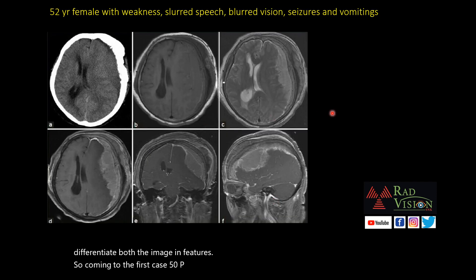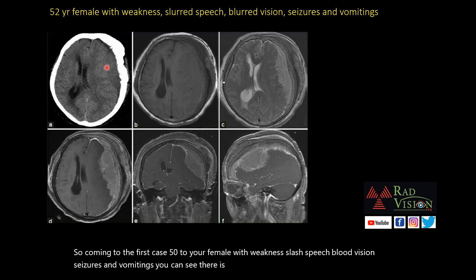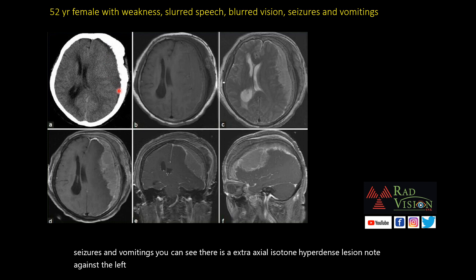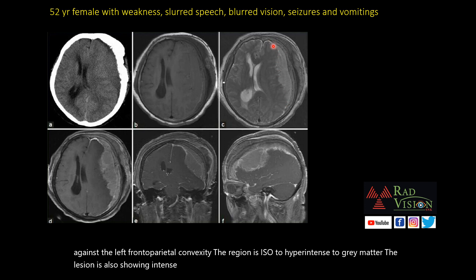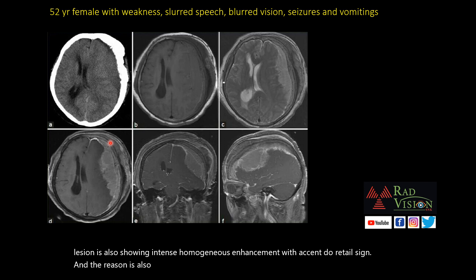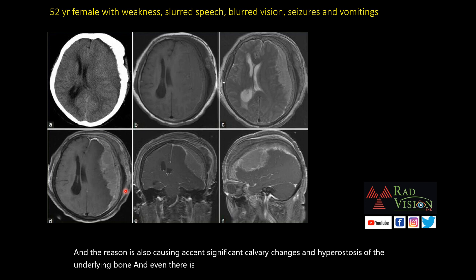Coming to the first case: a 52-year-old female with weakness, slurred speech, blurred vision, seizures, and vomiting. There is an extra-axial iso- to hyperdense lesion against the left frontoparietal convexity, iso- to hyperdense to grey matter, showing intense homogeneous enhancement with a dural tail sign. The lesion is also causing calvarial changes and hyperostosis of the underlying bone, with extra-cranial spread and significant soft tissue swelling.